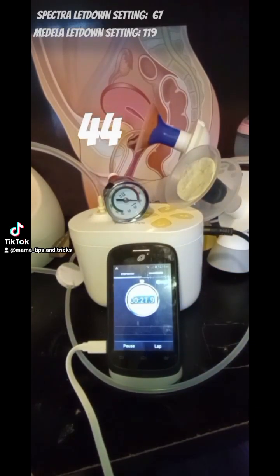It was a little harder to make sure that I was on the highest level for the Medela because there is no screen on this pump. You just have to push the buttons until it's all the way up. Speed is just one of the major differences between Medela and Spectra pumps.